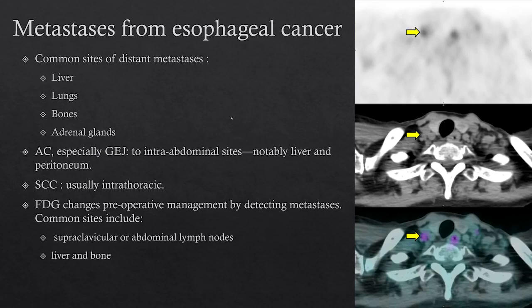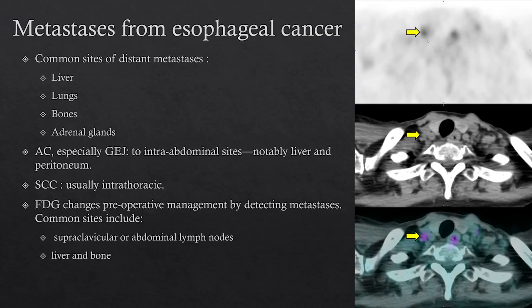Metastases from esophageal cancer occur at typical sites including the liver, lungs, bones, and adrenals. Adenocarcinoma, particularly at the gastroesophageal junction, is more likely to metastasize to abdominal sites such as the liver and peritoneum. With squamous cell carcinoma, metastases are typically intrathoracic. FDG changes can also alter preoperative management by detecting metastases — common sites are supraclavicular and abdominal nodes, liver, and bone. In this image, focal uptake is seen in a neck node in a patient with esophageal cancer.